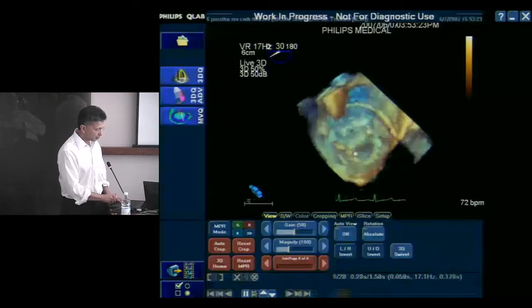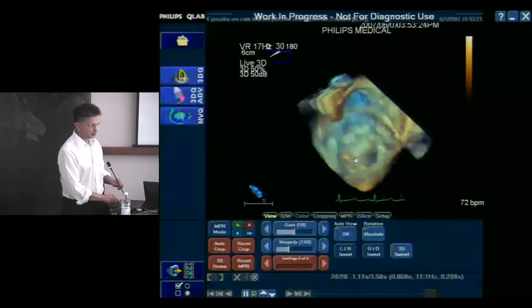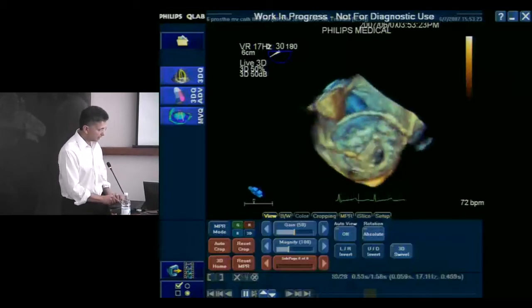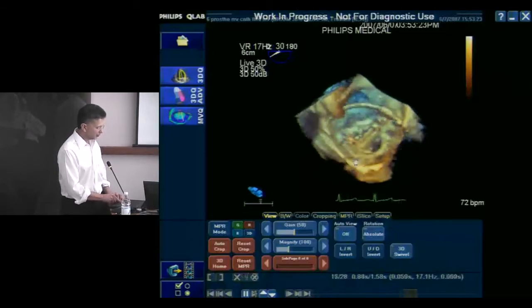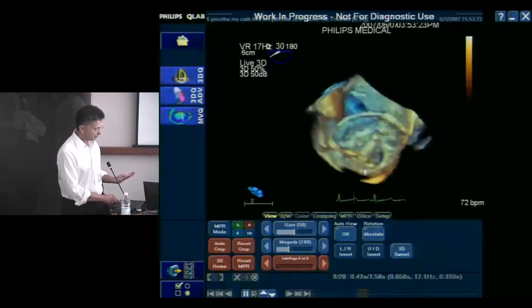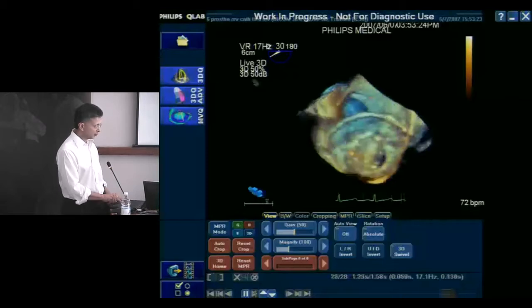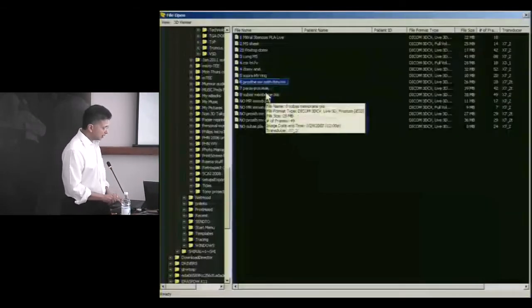Look at this catheter. It's going in straight between the 2 discs. That's not a good place for it to go through. So we encourage our interventionalists to pull it out. And then watch what happens right there. So over there, it turns out, and I'm not going to open up the second thing to show you this, but she had dehisced her valve over there. There was a complete gap over there, and so she ended up having to go to surgery. We were not able to kind of stall that.